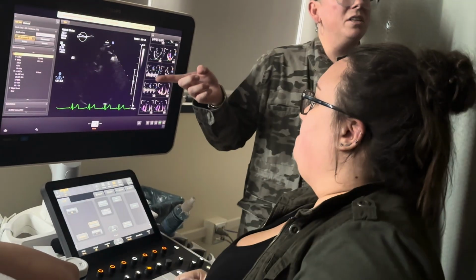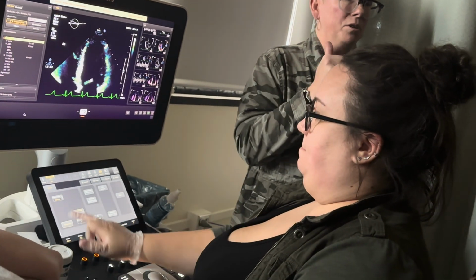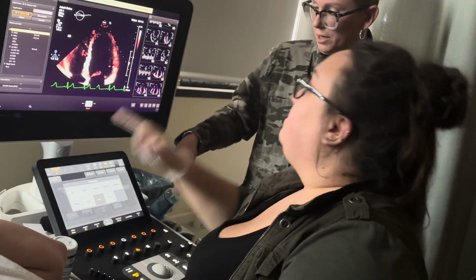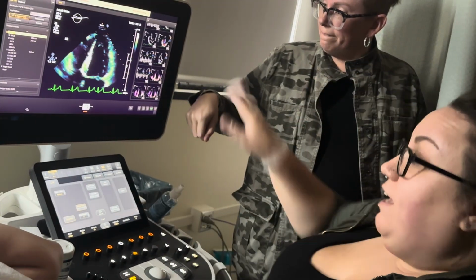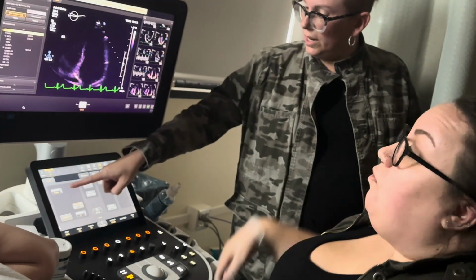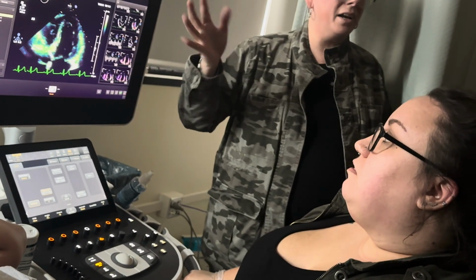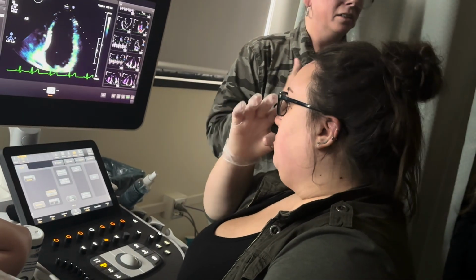So the reason we do this is because if you think about being a doctor that's looking at black and white photos all day long, and you want to see a better picture. I do rainbow. And that's so funny. Okay, Kelly prefers rainbow. I prefer thallium. I don't know why. It's so that they have something else to look at to watch all these walls move besides the gray. But then also, because you get sick of it. We get sick of it.